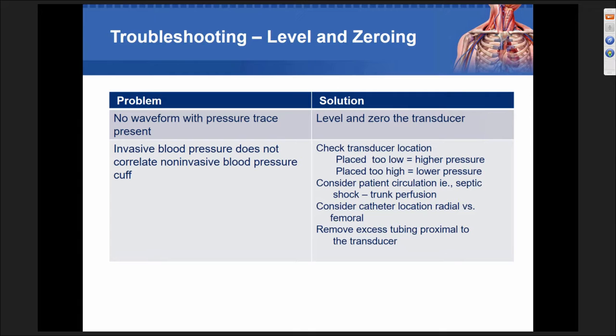You also need to remember that if you have an arterial catheter that dwells over time, products aren't perfect. If you have a transducer that just doesn't seem correct, you can't get a nice crisp waveform, or it just doesn't resemble the patient picture, change the transducer. I've had to do it about 5 times in my career, but that was absolutely the fix. Make a new setup, bleed your transducer, prime it, flush it, disconnect and reconnect, and you're going to connect to that stopcock. That's what that allows for.